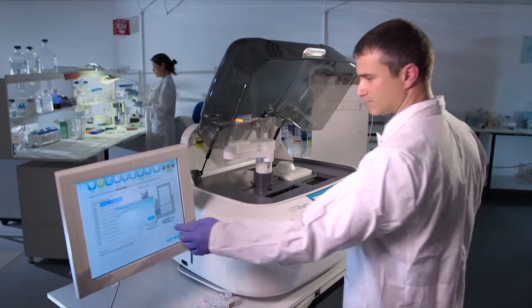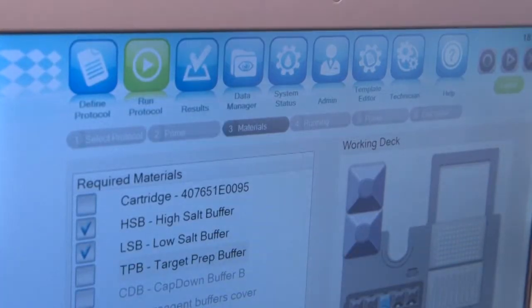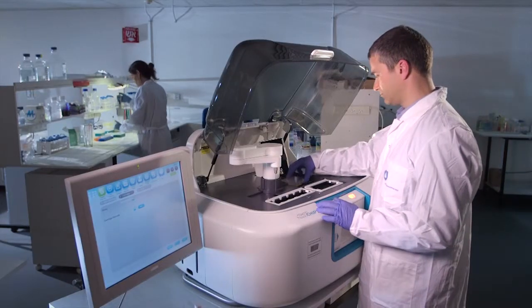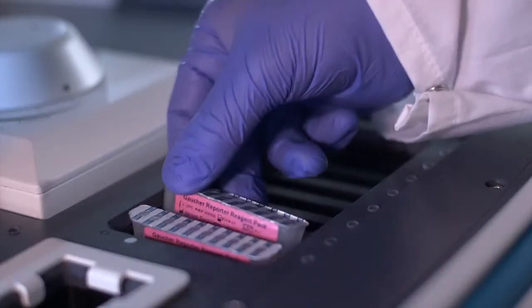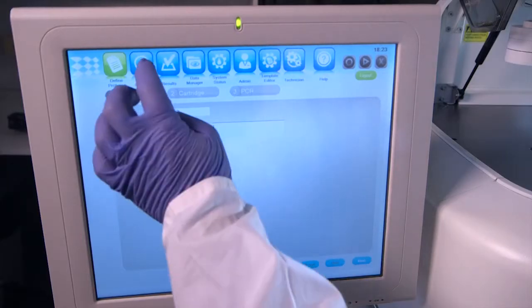Once DNA is extracted from the sample, amplification, detection and data analysis are performed automatically in a streaming continuous process. Just load your DNA samples, the detection reagents and the Nanochip cartridge into the system and press run.